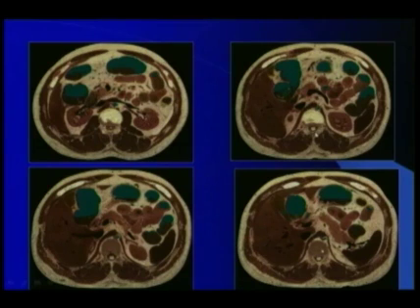Here we can see the anatomic cross sections, and this is the most caudal one. You see here just the uncinate process. This is the pancreatic head. You see here the portal confluence and splenic vein. When we go slightly upwards cranially, we can see the whole pancreatic body, and in the most cranial cut of these anatomic images, you can see the distal portion of the body and the pancreatic tail, which reaches the spleen.